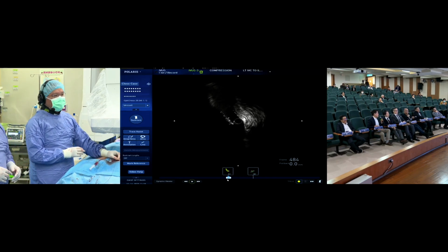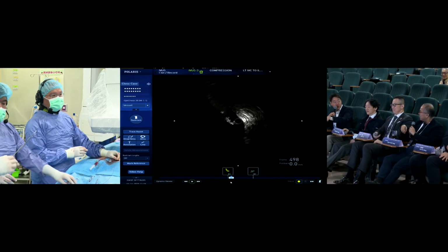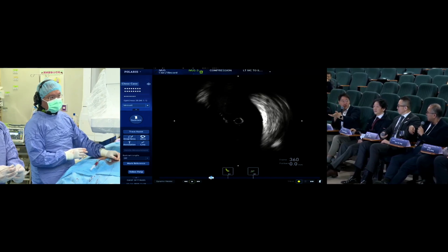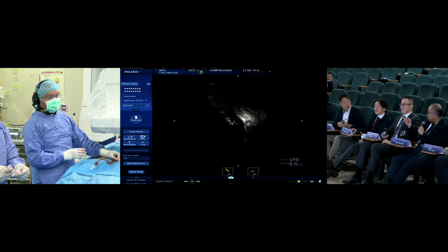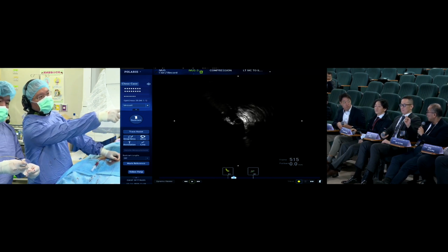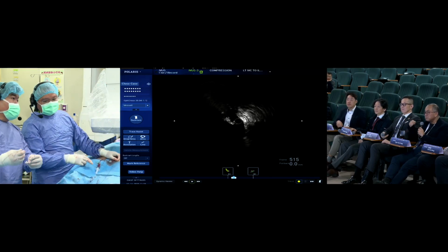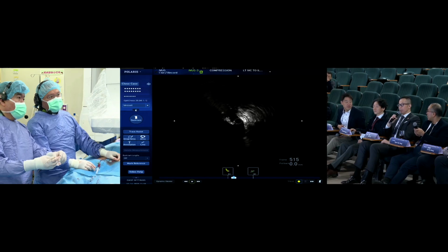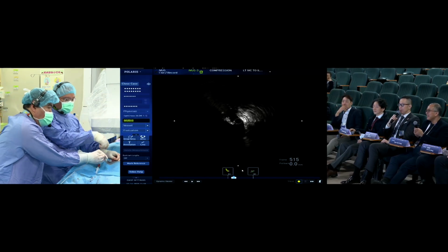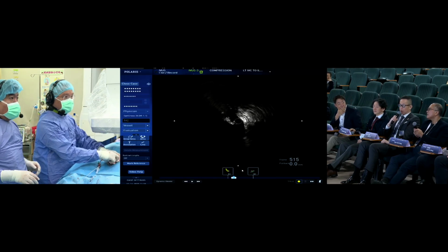I think it's because we're not relying on the balloon to remodel the vessel like in the arteries. We're trying to avoid dissection and stenting. Absolutely. Here, the primary goal is primary stenting. I just think that if you pre-model it like in the artery, the stent will fit better, and when you're right near the bifurcation, the stent doesn't jump as much. That's my only thinking on why you would do it a bit longer. For me it's the same. For MTS, I will quickly move to stenting. But for PTS, sometimes we do venography to check for any extravasation.